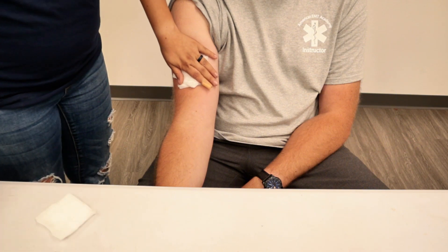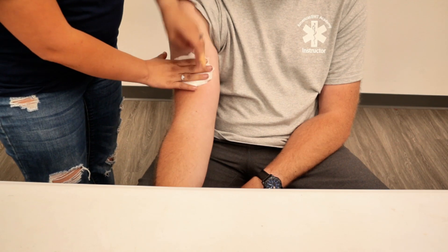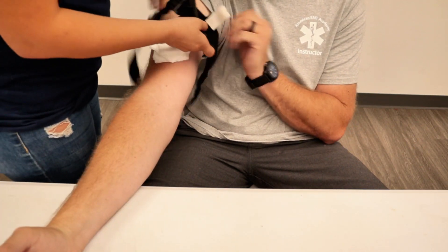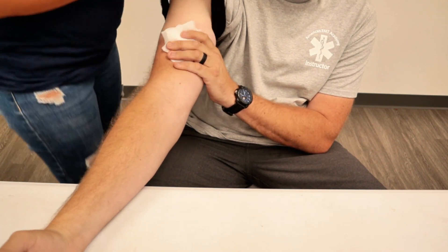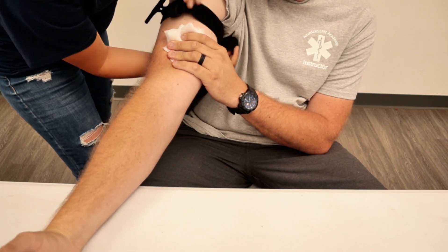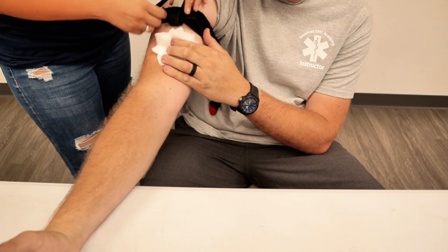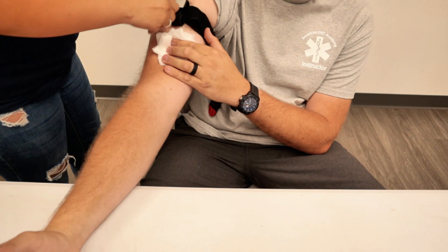If the patient is still bleeding after a decent amount of gauze, we're going to take a tourniquet. We're going to do it above the wound, as high as we can. We're going to take the tourniquet and cinch it down. We're not going to cross over because we still need access. We're going to take the windlass and just twist until there's stoppage of blood flow.